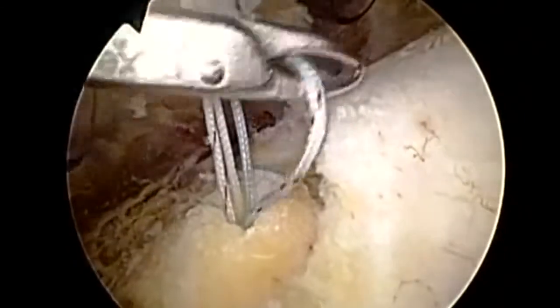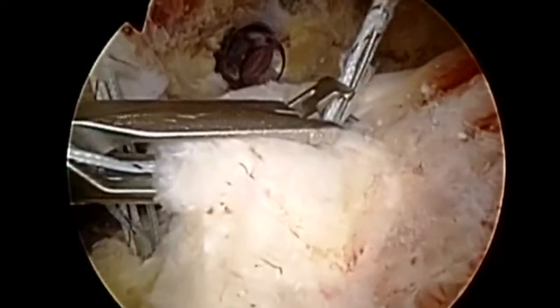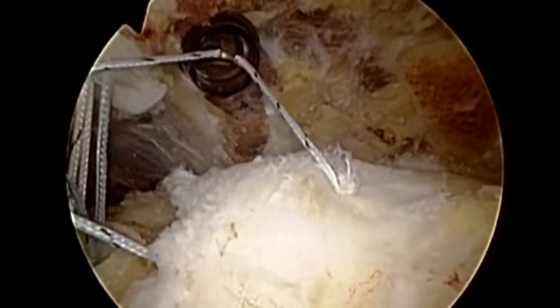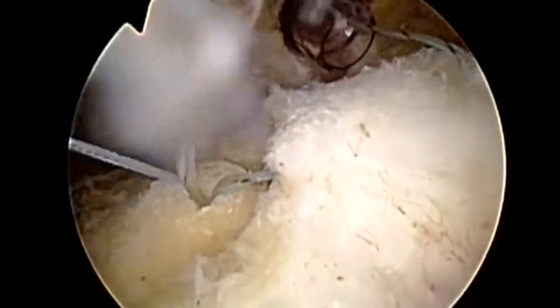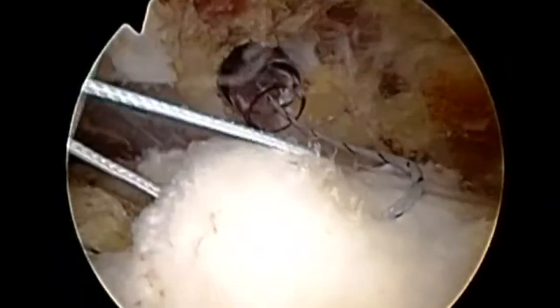Next, we'll place a large cannula laterally at our working portal, and we'll sequentially relay, grasp, and then use a Scorpion fast pass suture passer to get a good healthy bite of rotator cuff tendon and then relay out the anterior cannula. We'll do this with the second suture to complete our first horizontal mattress suture.